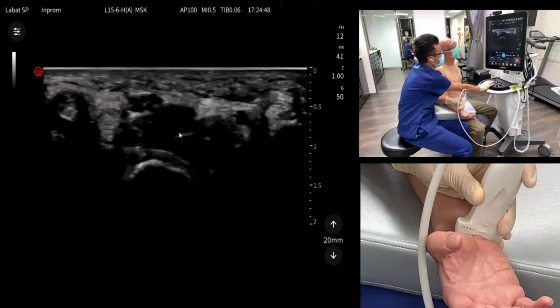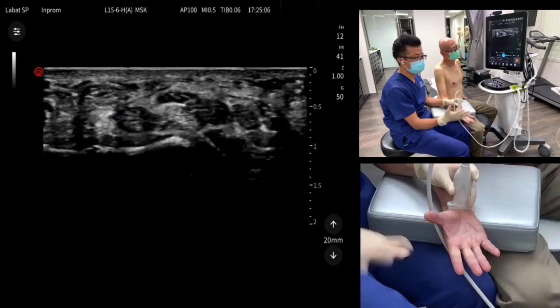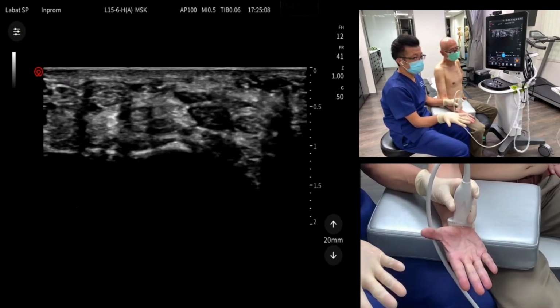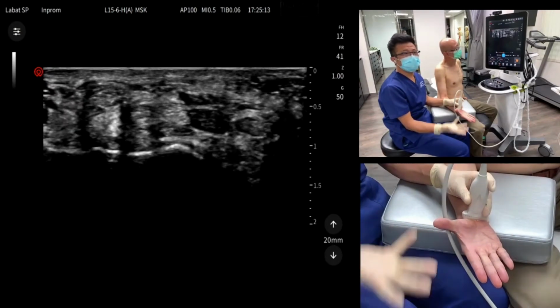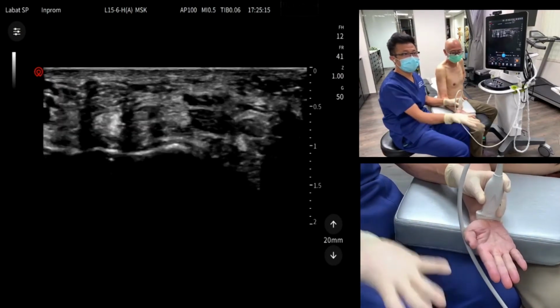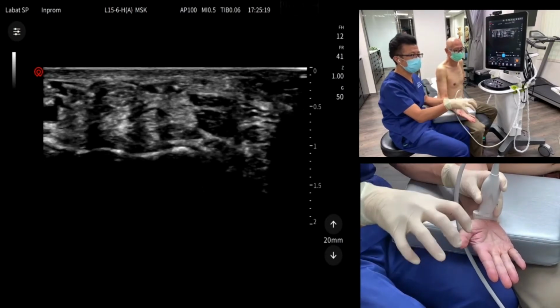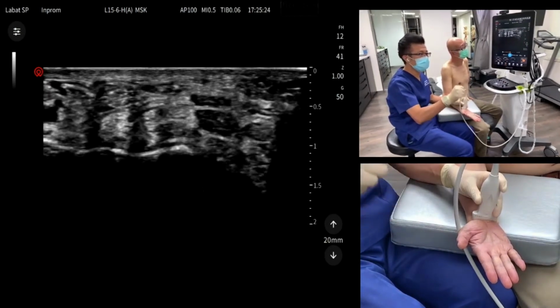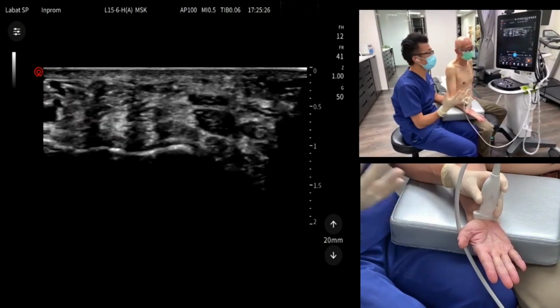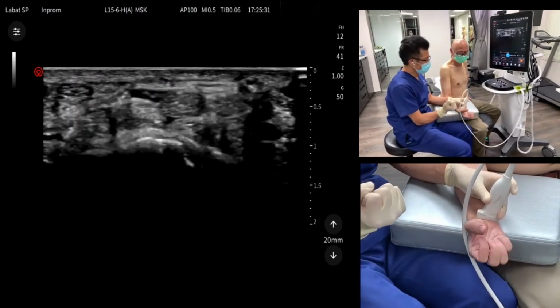Okay. So traditionally, you're going to ask the patient to do this palm up position, and then you assess the patient like that. But clinically, how many patients will show you they have problem like that? Usually they will have problem like this. When I'm typing, when I'm doing my housework, when I'm holding something, then I lost power and I have numbness and things go on. So can you squeeze like that?